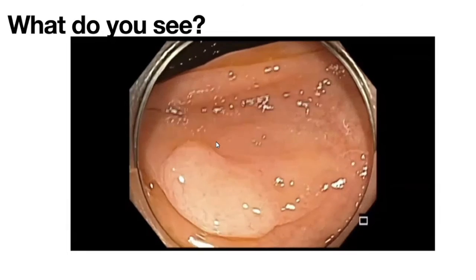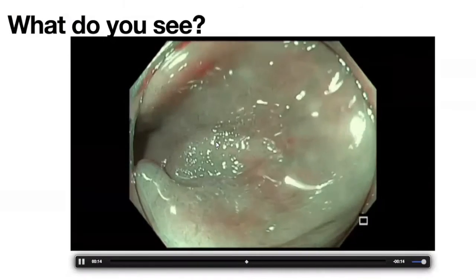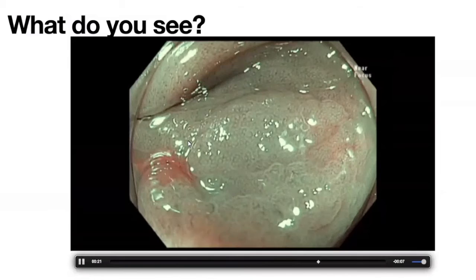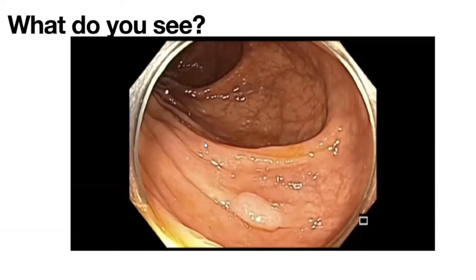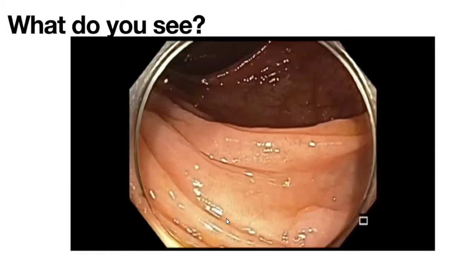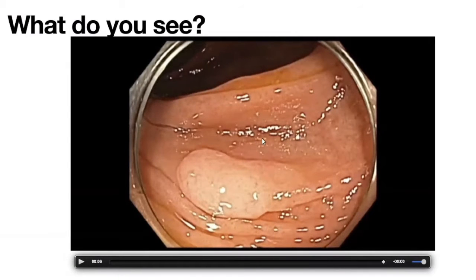So it was interesting, on NBI, it looks like the lesion may be larger than I initially thought. Yeah. It looks like it extends up higher. Right. So let's go back to the first video. Initially I thought that this lesion was here. Okay, you see the arrow? That's what I thought was a lesion. And then I thought, could I do a cold snare? And then as I took time to really examine, I thought that there is something else like a tail here, and there is something vague here.